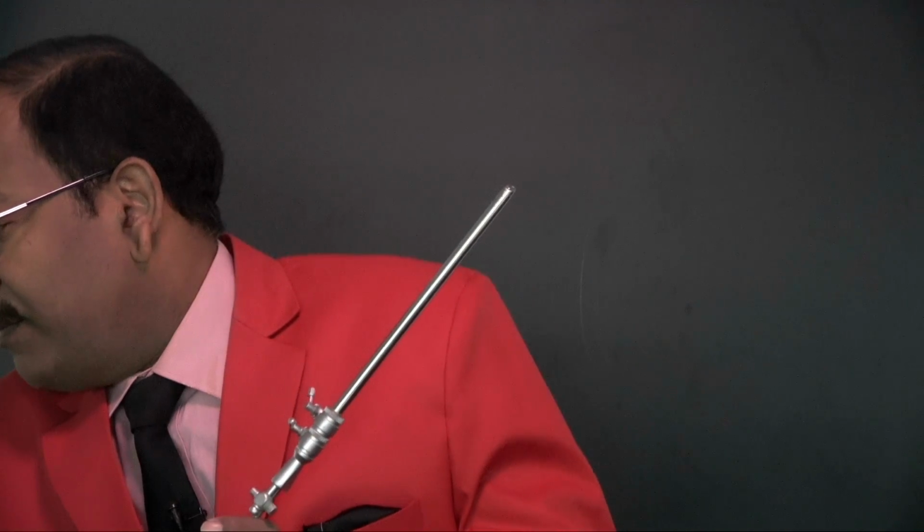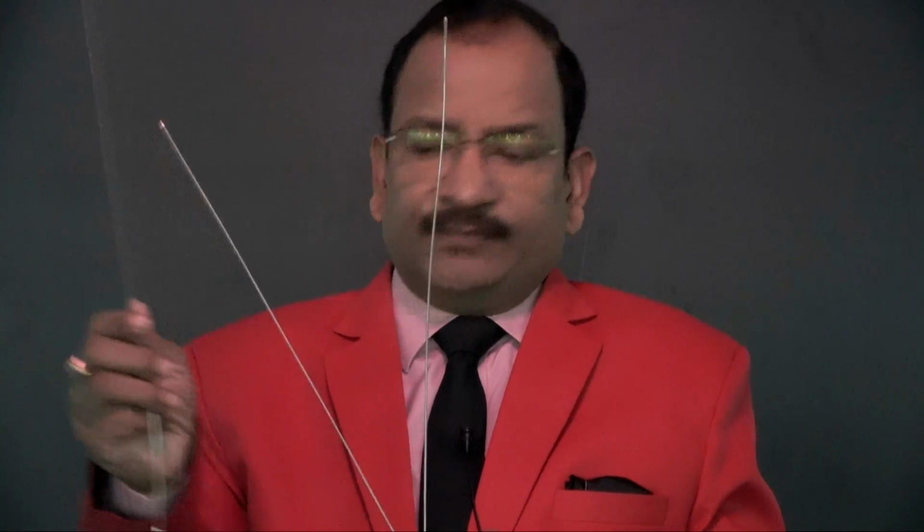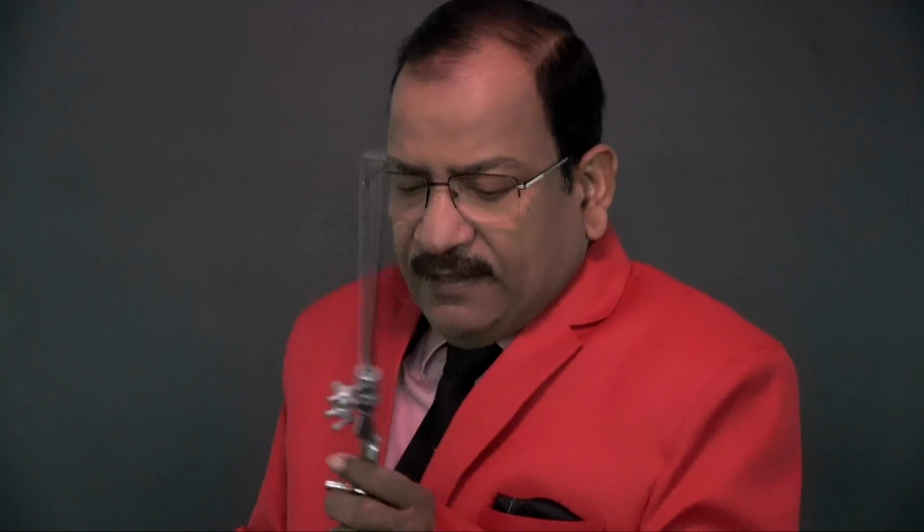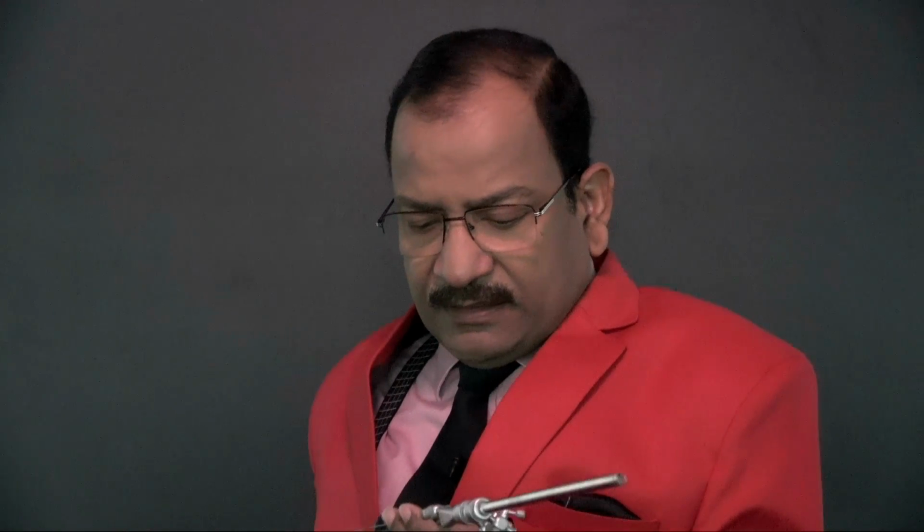So in this you have different sizes of instruments. These all are instruments. You have scissors, you have biopsy forceps, you have graspers, you have different flexible instruments. And these instruments I can introduce by this channel. This is the working channel and this instrument is in.